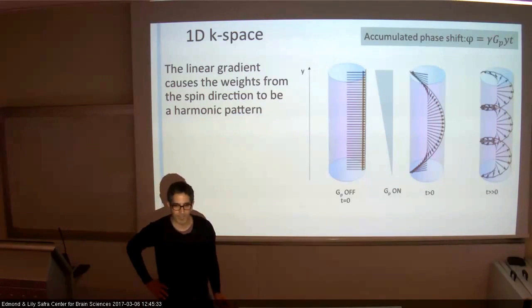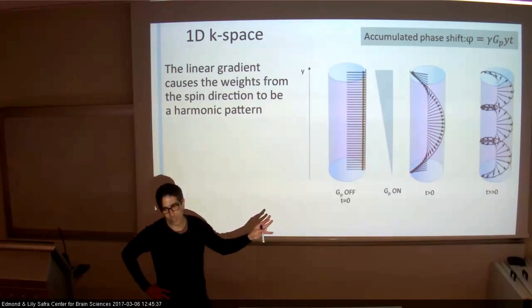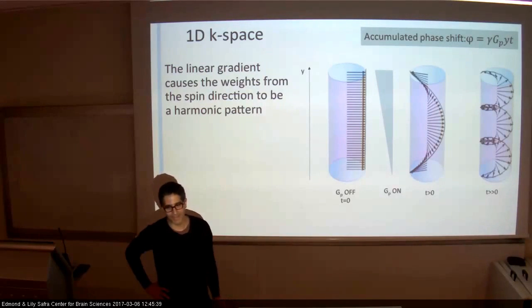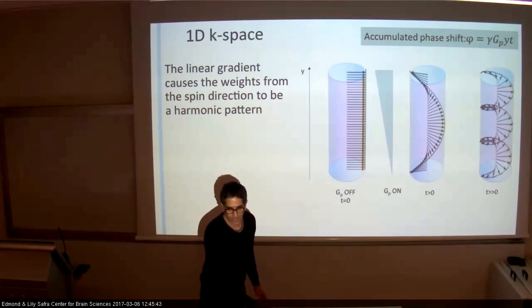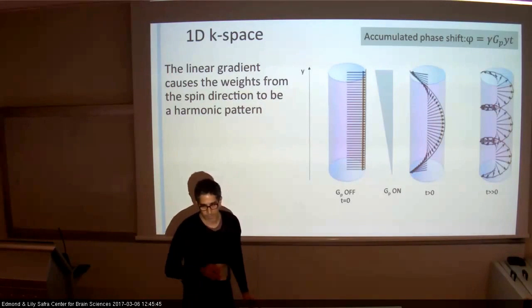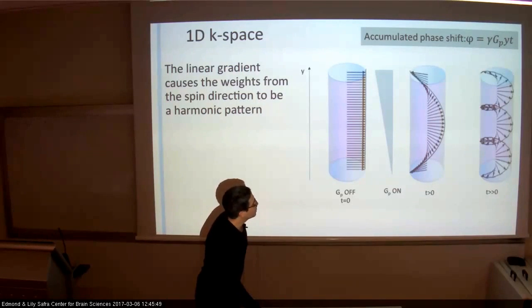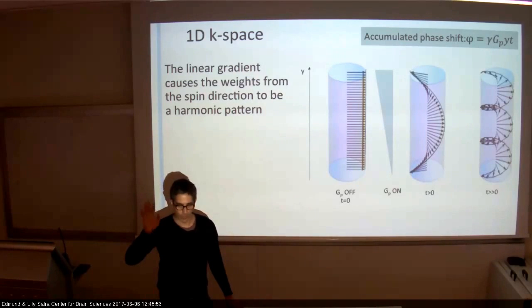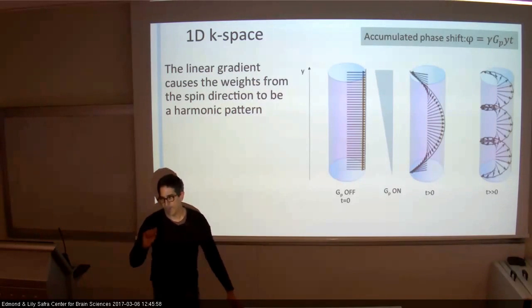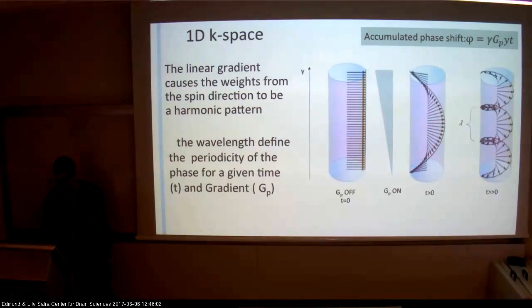Say it again? Do different tissues accumulate phase? Yeah, this is only about position. Yes. Let's say yes for now. For these gradients, yes. Yes, because you should think that you only look at the water protons anyway, which have only one Larmor frequency. So yes. Time. One more slide. That will be exactly the time to shift.